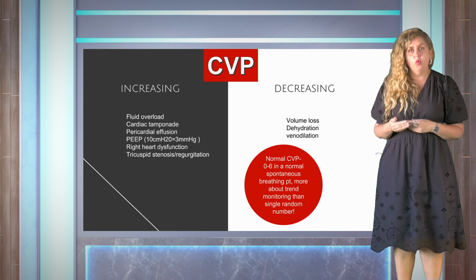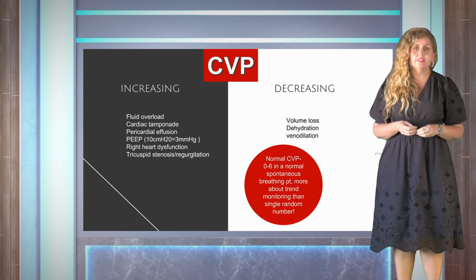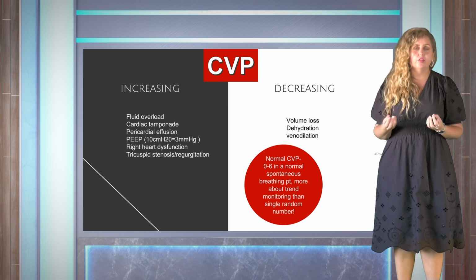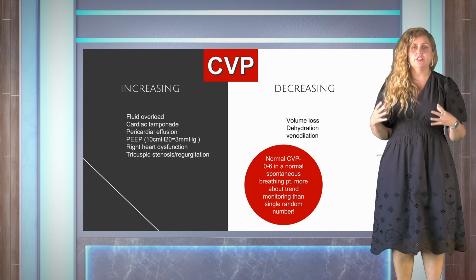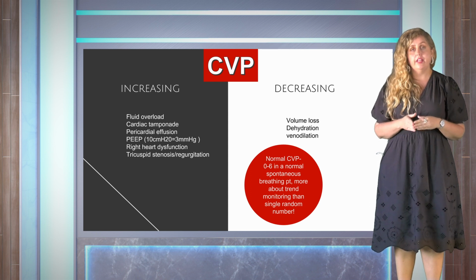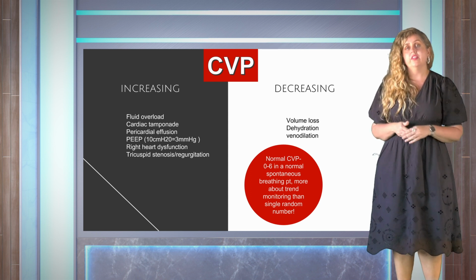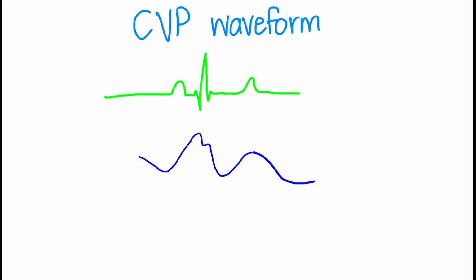You can do more investigations and a more holistic exam, taking more factors into account, and then you can have a look, is a diuretic needed or so on. You need to see the patient as a whole, but the CVP monitoring is definitely valuable in setting you off in a direction. So let's have a look in more detail at the CVP waveform.